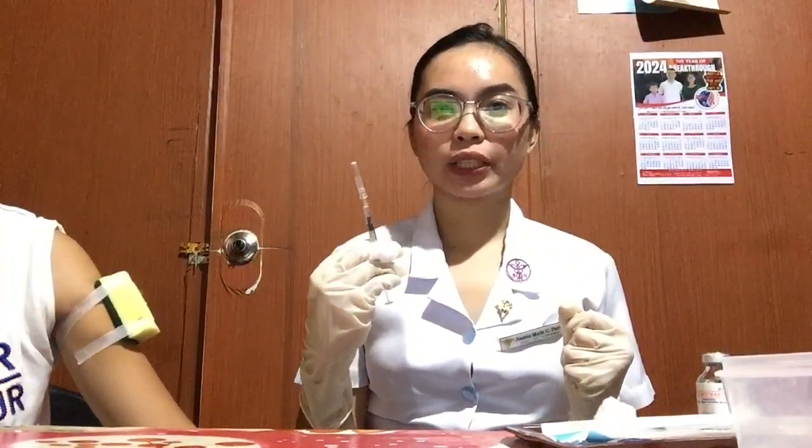And now prepare the syringe for injection. Remove the needle cap while waiting for the antiseptic to dry, and pull the cap straight off to avoid contaminating it. Then inject the medication by grasping the syringe in your dominant hand, holding it between your thumb and fingers, with the palm facing to the side or upward for a 45 degree angle insertion, or with the palm downward for a 90 degree angle insertion, and prepare to inject.